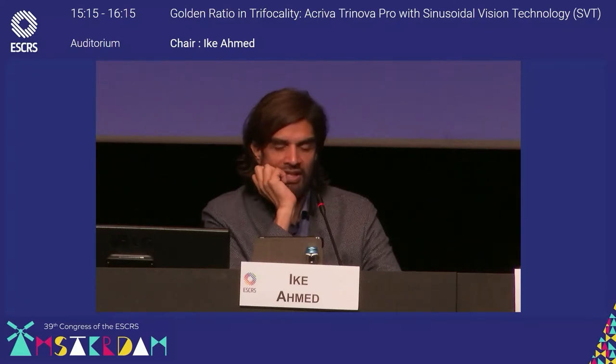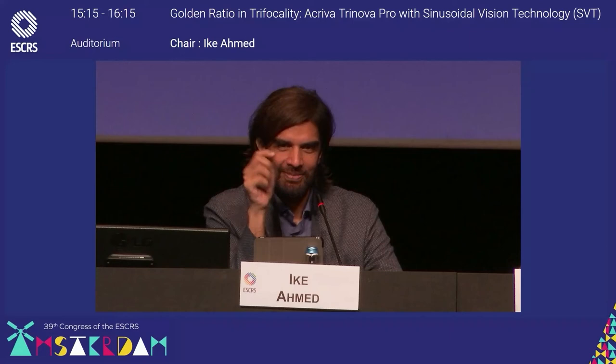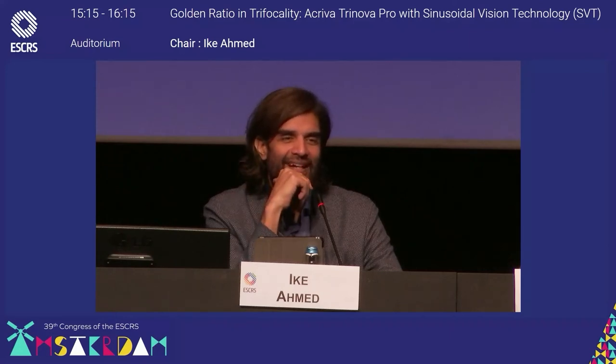I know we're getting down toward the end here, but there's a question about what dioptric range is available for this lens. It's 0 to 34 diopters, which I think is an excellent range. When will it be available? It's available basically now, as far as I know. I hope I didn't lie. After this session, yeah.